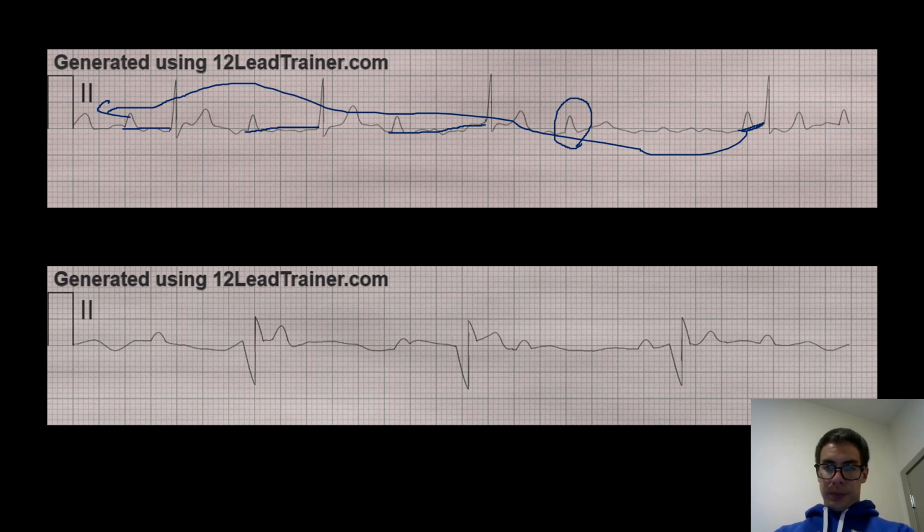On our second one, is the rhythm regular? Yes. What is our rate? Well, we got 300, 150, whoops, 100, 75, 60, 50, 40, 30-ish. And using the other method to count, it's also 30, so heart rate's about 30, we can say pretty accurately. So that would tell us intrinsically this is at a ventricular rate because it's pretty slow. So it's within that ventricular intrinsic rate.